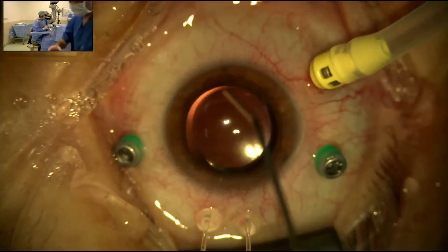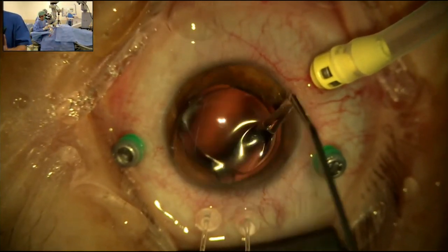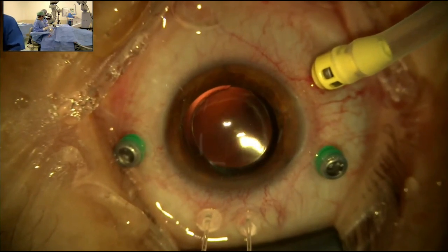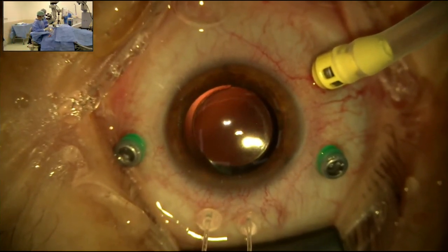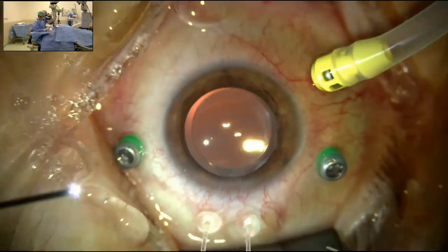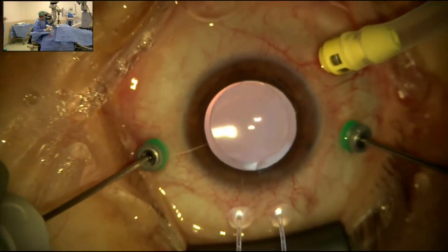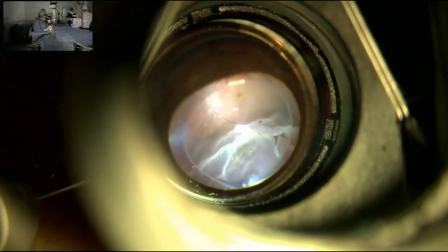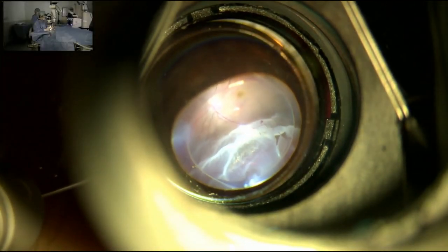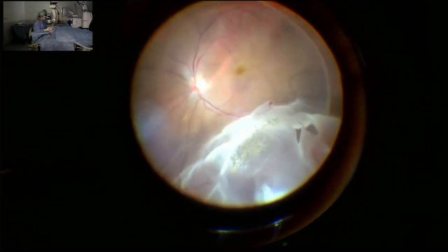I use methylcellulose to keep the cornea clean and wet during surgery. And now we'll start with the vitrectomy and we will go into the eye. As you see now, I think you can see the vitreous cavity.